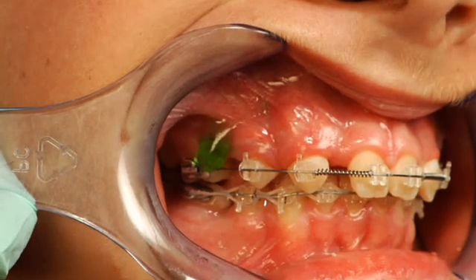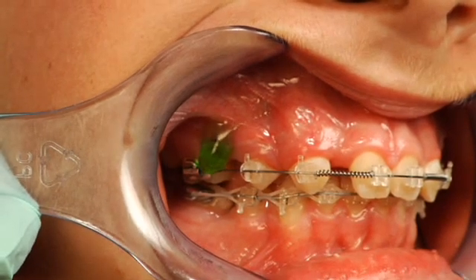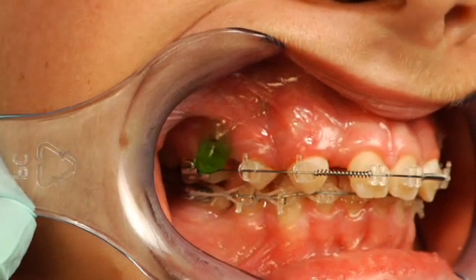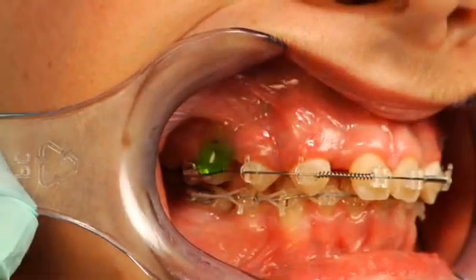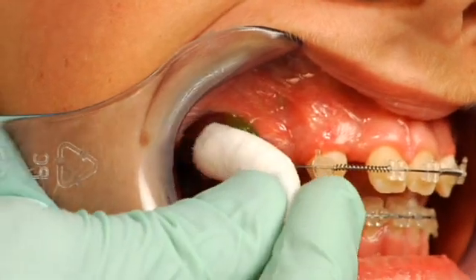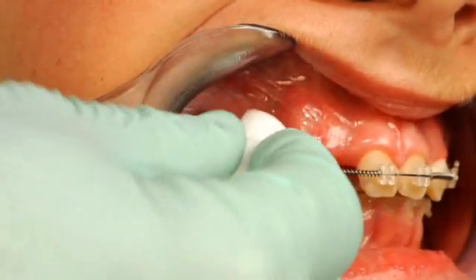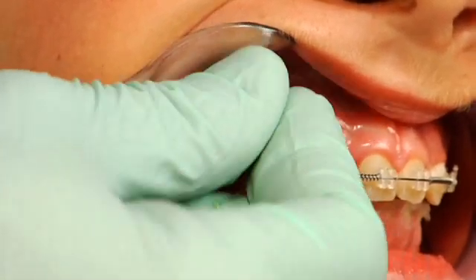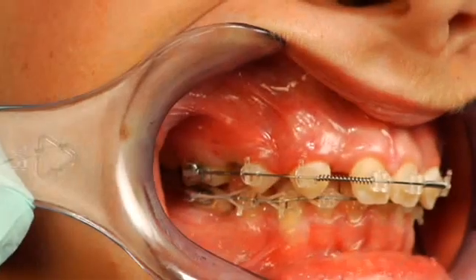The phenylephrine is a vasoconstrictor. It helps retain the topical anesthetic in the field, and it also helps with hemostasis control. Once the topical anesthetic has been in place for three to four minutes, we're going to wipe that off. We prefer to wipe it off rather than rinse it off just because it's so profound — there's not really any reason to have it going all over the mouth.